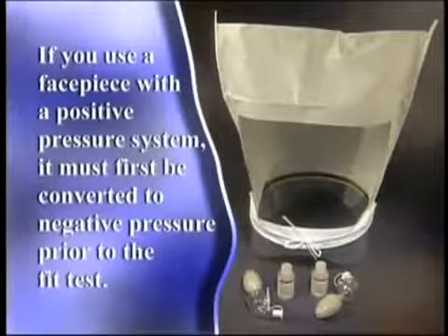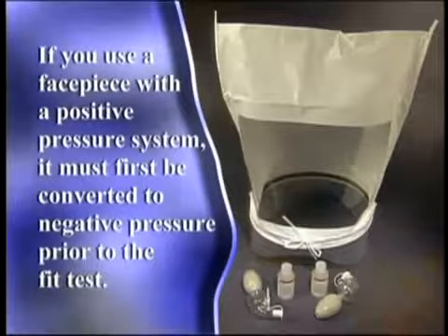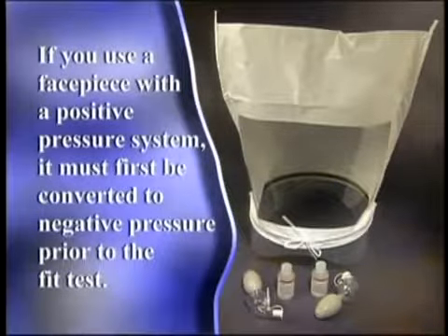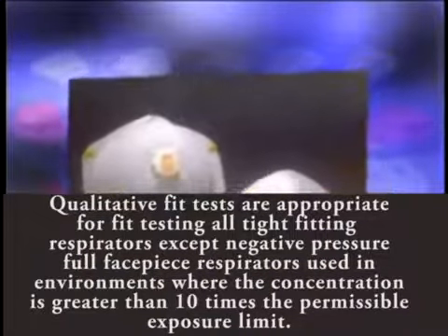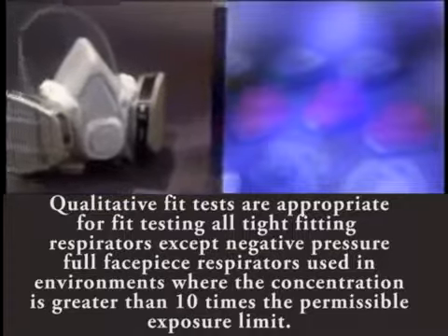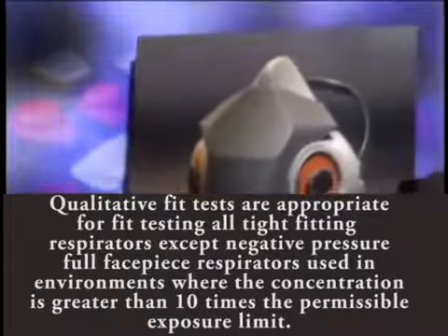The proper fit of your respirator must be confirmed with a fit test before you wear the respirator in a contaminated atmosphere. This must be done for all tight-fitting facepieces. If you use a facepiece with a positive pressure system, it must first be converted to a negative pressure prior to the fit test. Qualitative fit tests are appropriate for fit testing all tight-fitting respirators except negative pressure full facepiece respirators used in environments where the concentration is greater than ten times the permissible exposure limit.